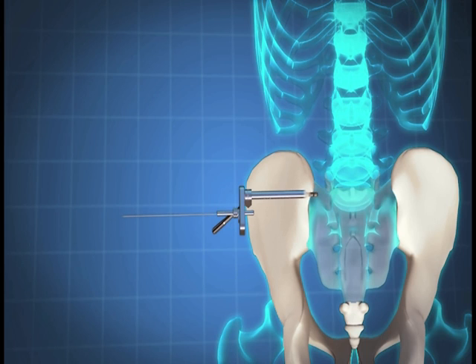Place the second Steinman pin into the parallel guide sliding block. Using a mallet, advance the pin until lateral to the level of the S1 and S2 neuroforamen. Remove the parallel guide and drill guide and repeat the entire procedure for insertion of the second implant. A third or fourth implant may be inserted using the same technique. The third implant should be located just above the S2 foramen level.